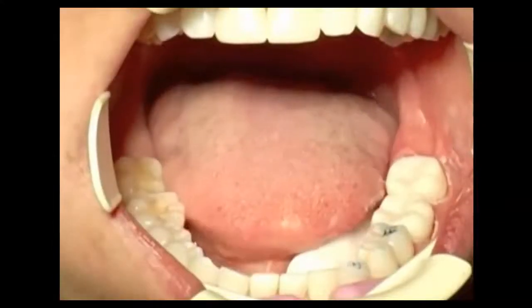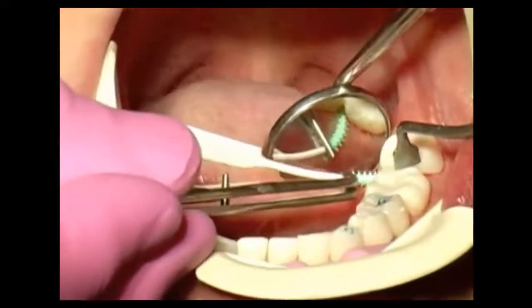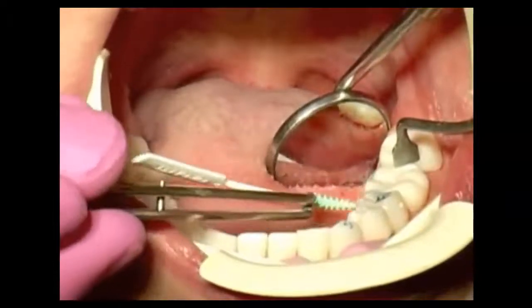Again, flossing to make sure there's no cement that's stuck in there. You don't want it to irritate the teeth or the gum tissue.